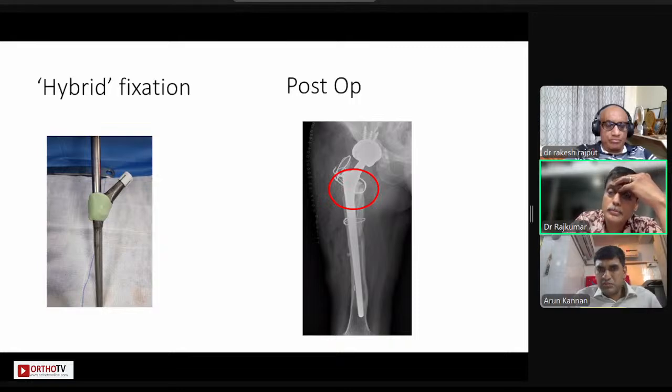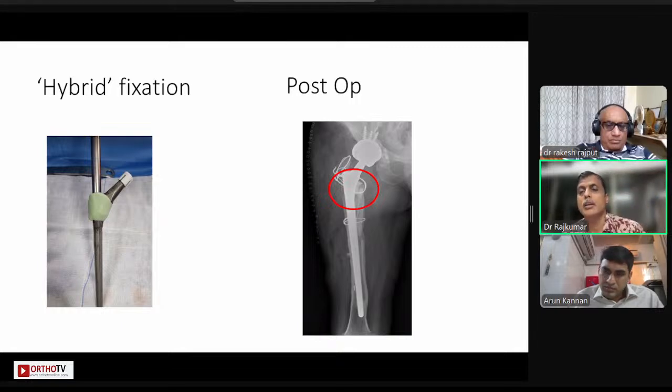Yeah, this is probably just an inch, just in the proximal-most portion. So don't you think it will give you a false fixation in the proximal part before you even start loading the distal one? The whole concept is making the distal portion uncemented, and then how the load is transmitted through the proximal bone may in fact hinder osteointegration between the bone and the implant.